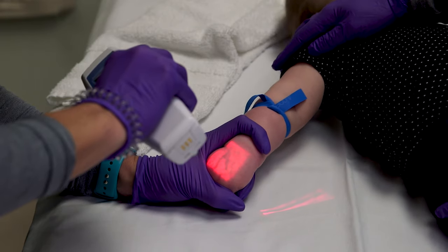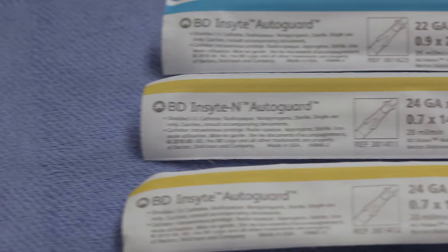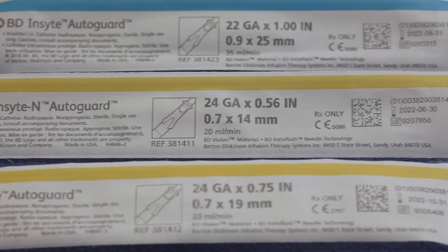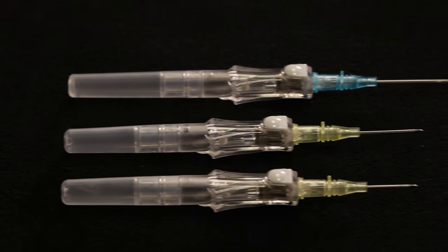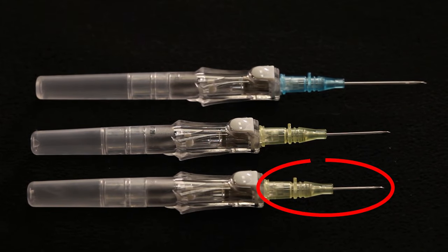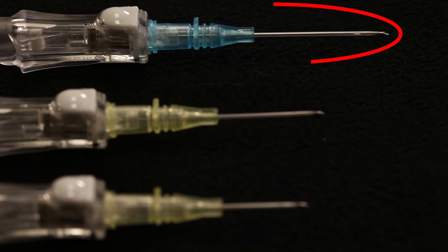Once you've found the vein you'll use to start the IV, you'll need to choose a catheter. We recommend 24-gauge catheters for infant hands and feet. The 24-gauge catheters come in two lengths — the shorter one is better if the vein is really superficial or if you can see a bifurcation, but in the AC and saphenous, the longer catheter can help prevent an IV from migrating out with movement. 22-gauge catheters may be used for larger AC or saphenous veins.